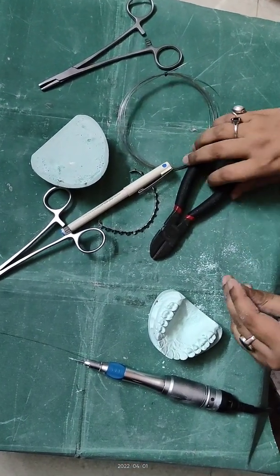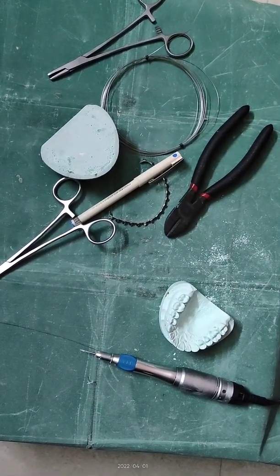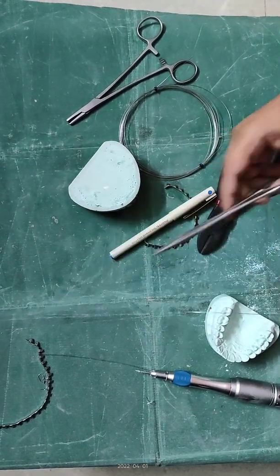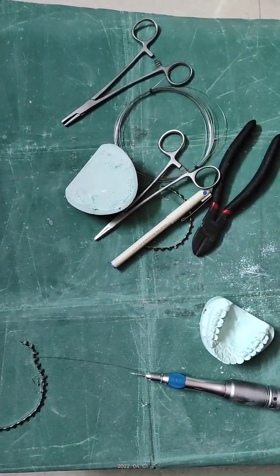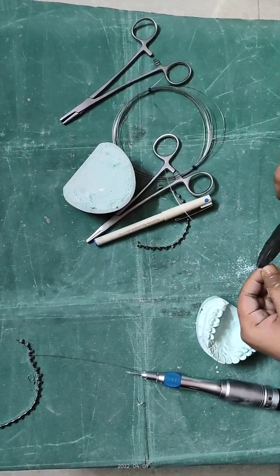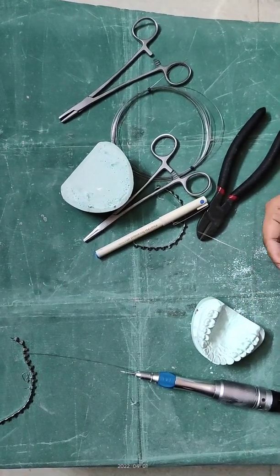Cut the wire ends and cut these wires into pieces approximately 10 to 12 cm. Make multiple wires of equal length.